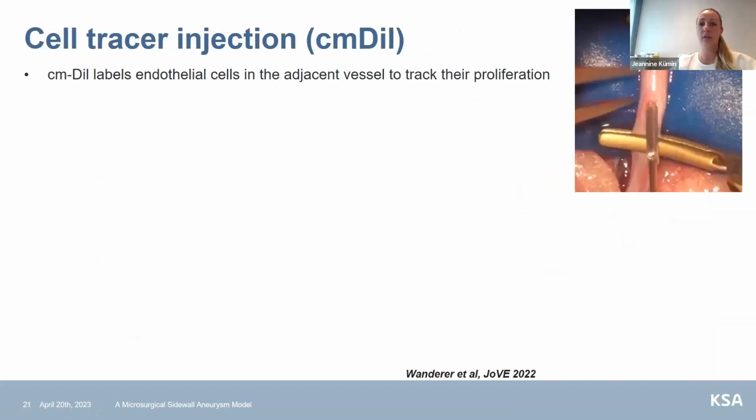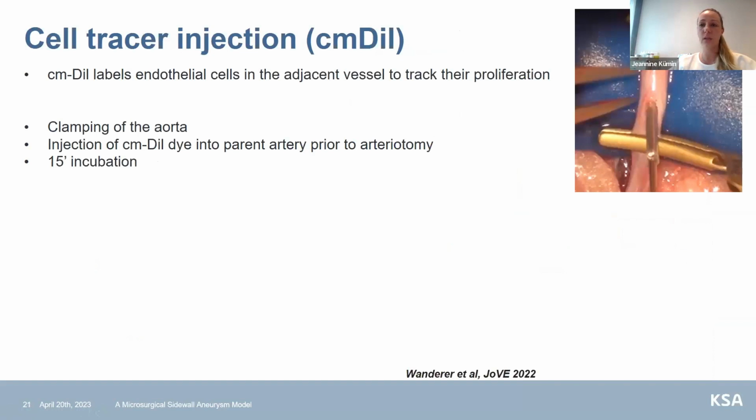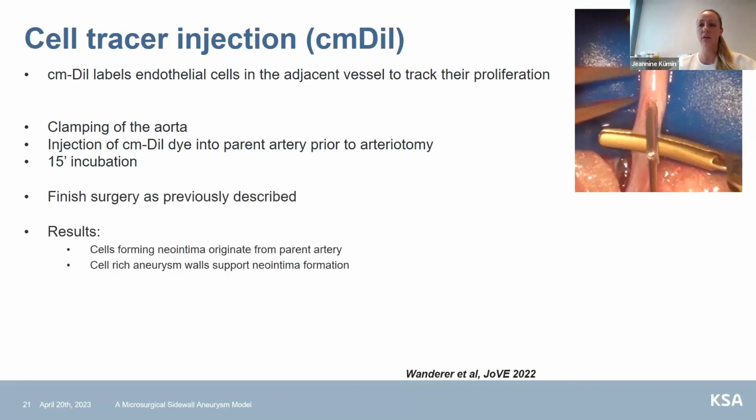Another kind of injection, not into the aneurysm, but into the parent artery, is the cmDil dye. cmDil is a dye that labels endothelial cells in the adjacent vessel to track their proliferation. So after the standard procedure with clamping and dissecting the aorta, we injected the cmDil dye into the parent artery with a very small catheter or a small needle. And then after 15 minutes of incubation, we finished the surgery as previously described.